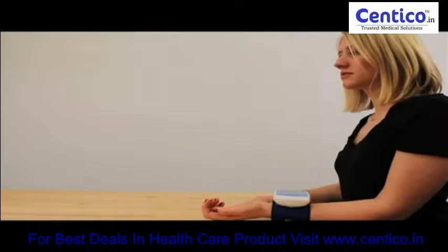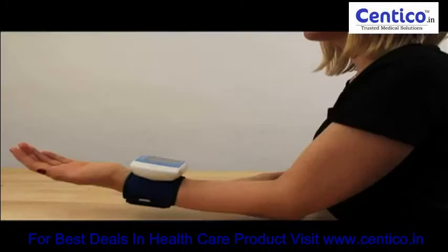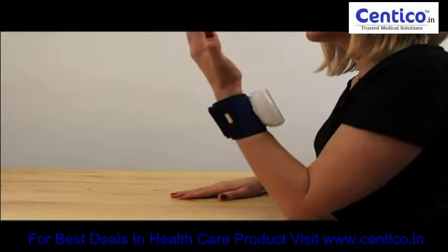Place your feet flat on the floor. Rest your elbow on a solid surface with your palm facing upward. Raise your hand so the cuff is at the same level as your heart.